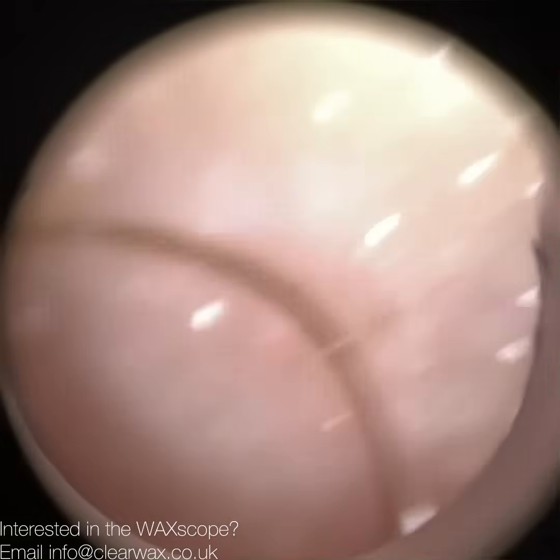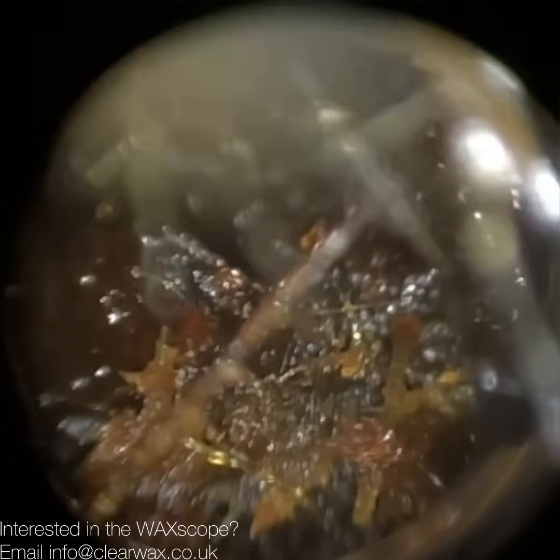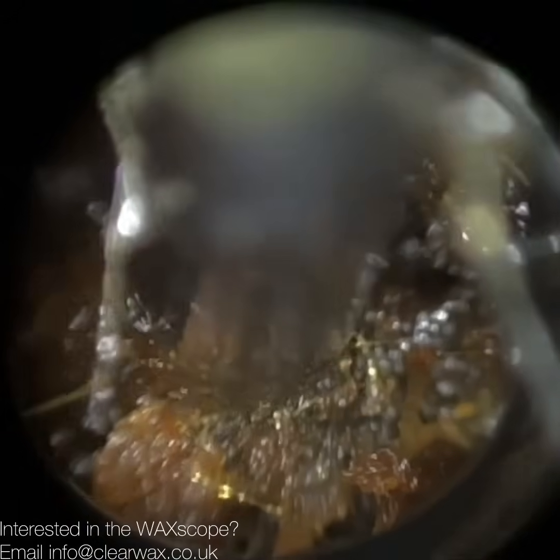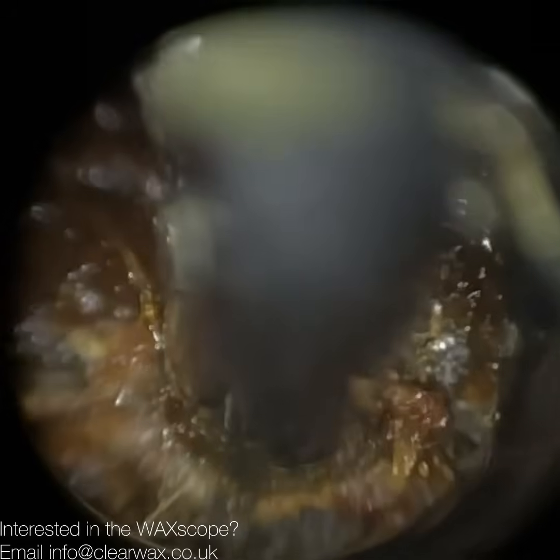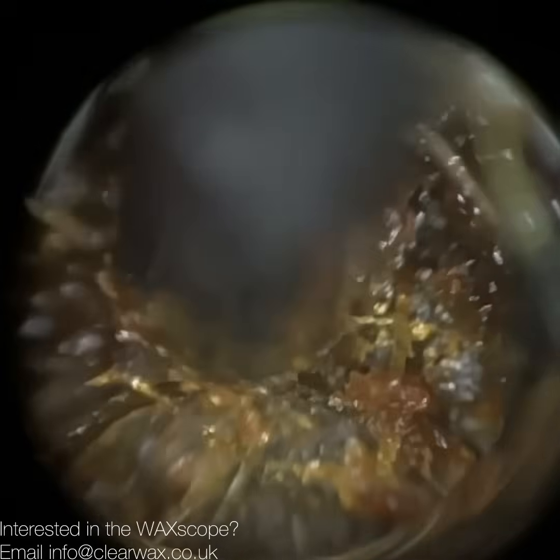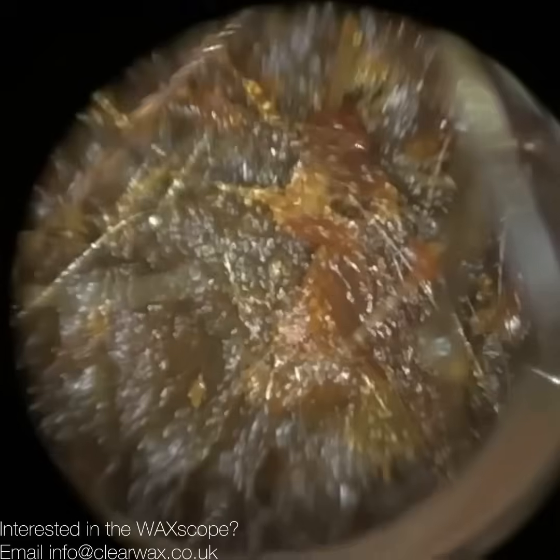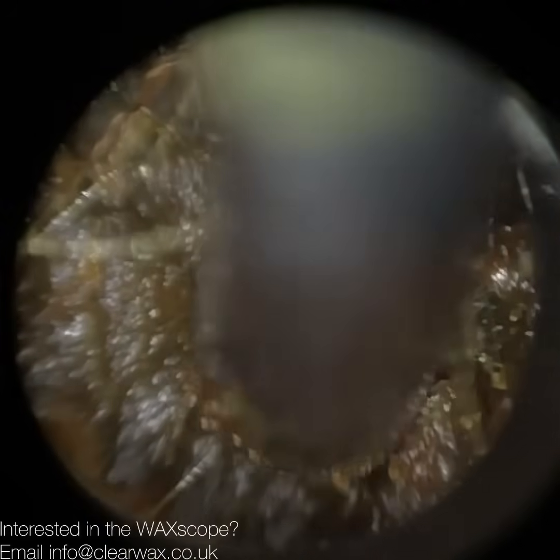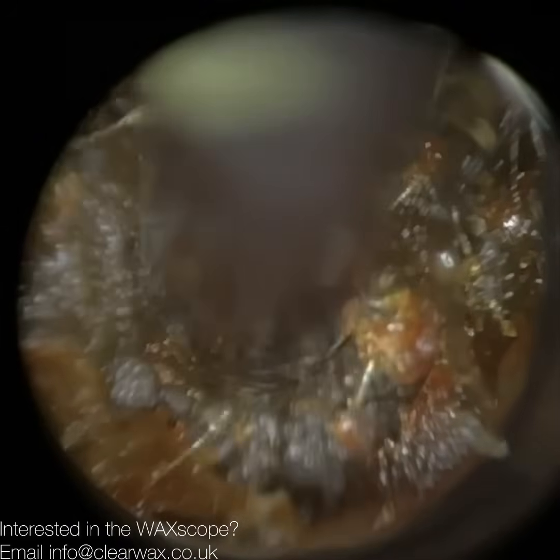So if the infection doesn't clear, an ENT surgeon has no option but to drill away that mastoid bone. And when they drill away, especially in the case of a cholesteatoma, just to make sure the cholesteatoma is fully removed, because if it's not fully removed, this cholesteatoma has the potential of regrowing itself, they generally can drill into the ear canal as well. So they make a widened ear canal. They merge the mastoid bone with the ear canal. So you just get much better visualization. You can ensure any traces of cholesteatoma are removed.